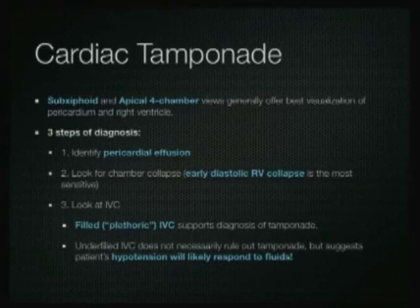And even when you see a filled IVC, that doesn't mean that the patient doesn't need fluids, because these patients need very, very high filling pressures to overcome the intrapericardial pressure and maintain their cardiac output. So continue to give fluids.